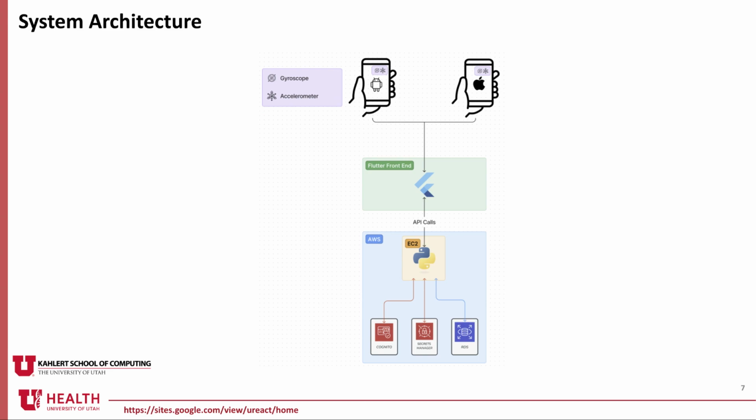The Python server had many functionalities. It ran the mathematical scripts that analyzed the data from our tests. It connected to an RDS database that allowed for us to store patient information easily. It connected to Secrets Manager, which allowed us to keep everything secure and organized. And it connects to Cognito, which allows us to create a secure login for our users that can be multi-organizational.